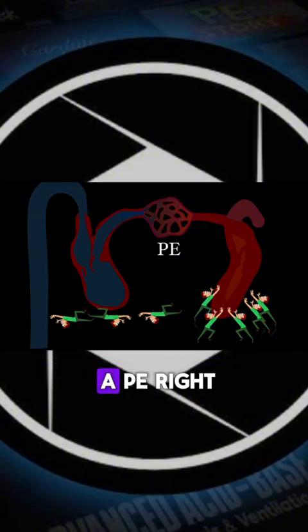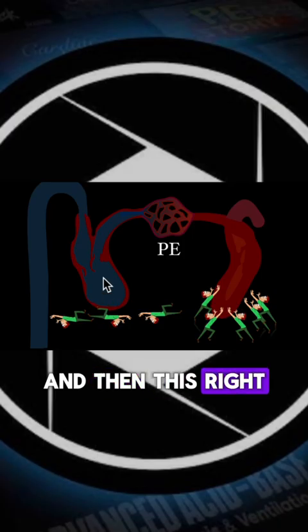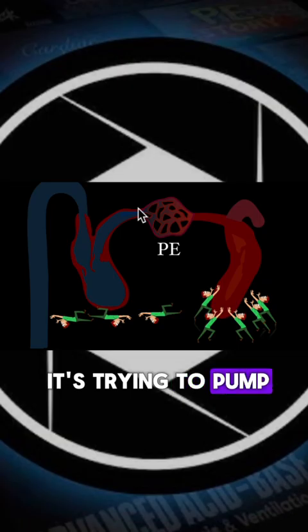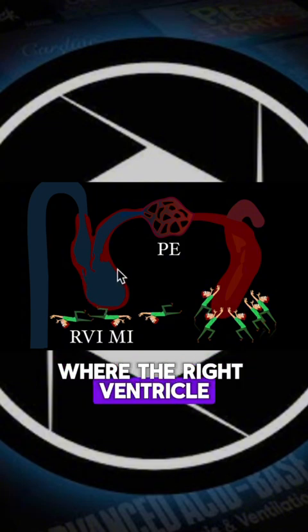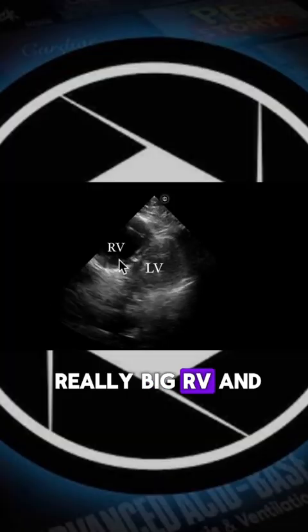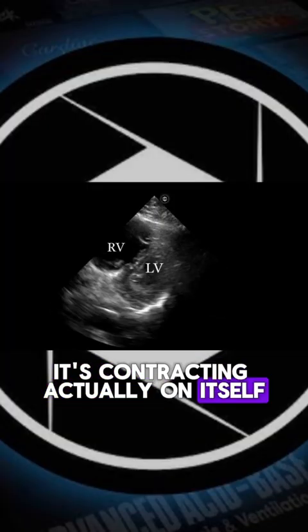And the two main causes of that are going to be things like a PE, right? You get a clot up here inside the pulmonary artery, and then this right ventricle has this huge clot burden it's trying to pump blood past. Or you could have something like a right ventricular involved MI, where the right ventricle just completely loses inotropy. And so on ultrasound, you look and you see something like this, where you have this really big RV and an underfilled LV. It's contracting actually on itself.